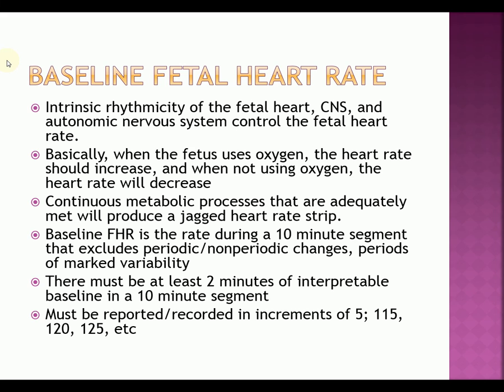And the same thing with the baby. If the baby's chugging along at about 140 beats per minute on his little fetal monitor, and then he moves, he uses up oxygen, and his heart rate should increase. And it should increase by at least 15 beats per minute for us to be able to determine whether or not he's oxygenating well.